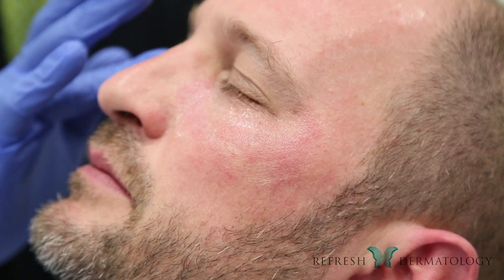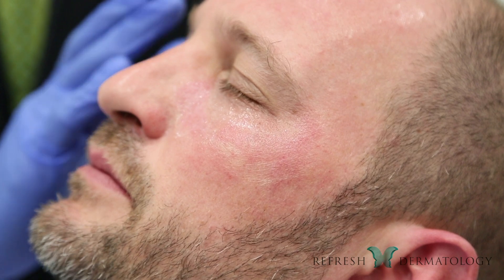The way the laser works is we take the laser beam and actually fractionate it into 169 micro dots. The laser energy is broken into those little micro zones — those micro thermal zones — which then penetrate the skin.